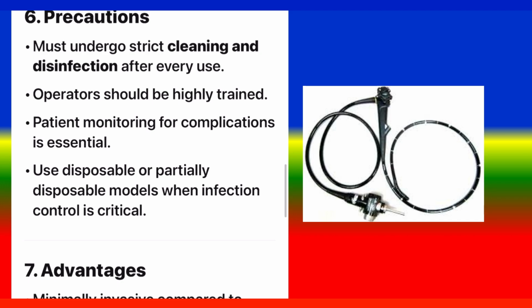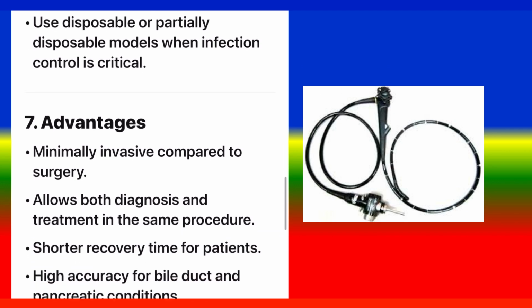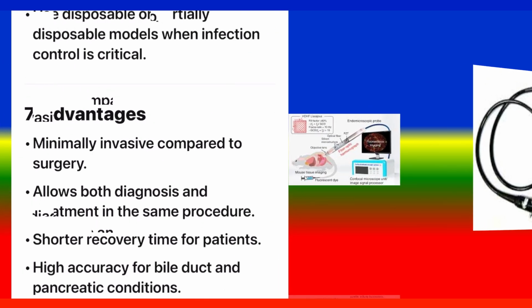6. Precautions. Must undergo strict cleaning and disinfection after every use. Operators should be highly trained. Patient monitoring for complications is essential. Use disposable or partially disposable models when infection control is critical.